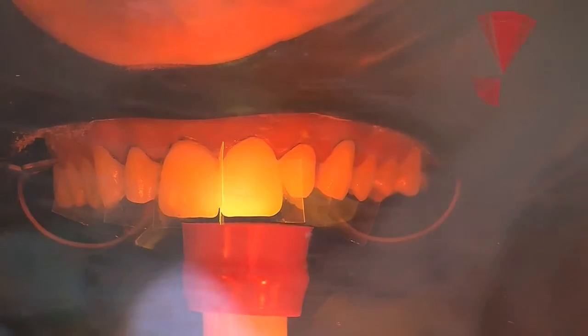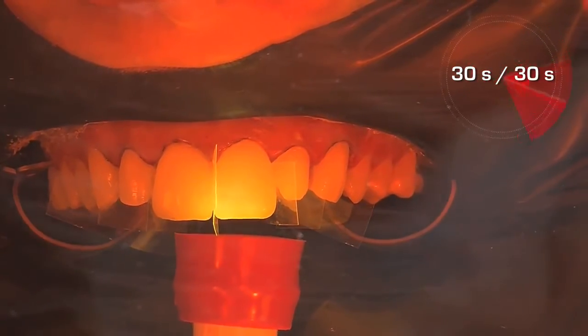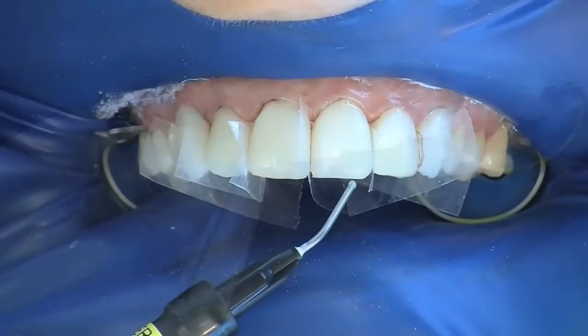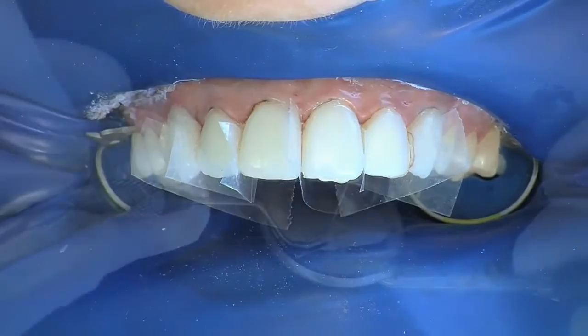With the componeers in the correct position, they are light cured — firstly palatally and then buccally, each for 30 seconds. Further componeers follow in the same fashion. The marginal areas can then be sealed with a flowable composite to ensure marginal integrity.